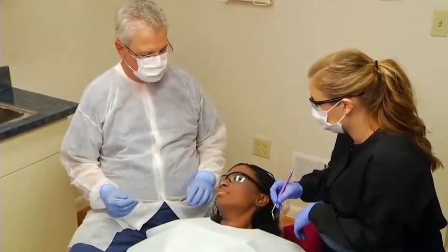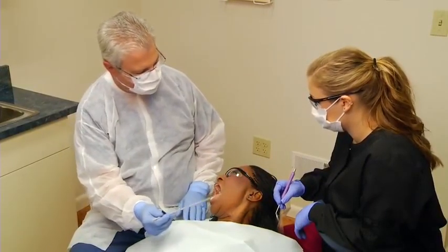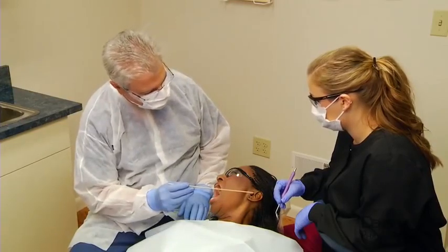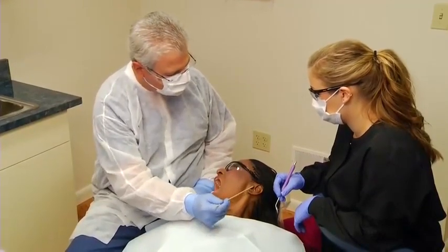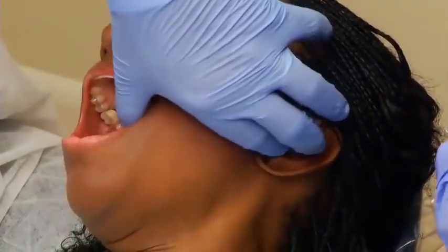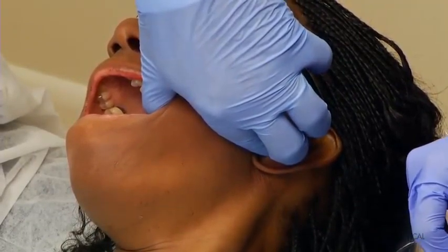The patient is requested to open maximally for this injection. External landmarks, the angles of the mouth, and the inferior border of the tragus are visualized and the plane of insertion identified. The flare of the tragus is also evaluated to determine the angulation of the syringe within the insertion plane. The cheek is then retracted with the left hand. For convenience, the thumb may be placed on the anterior border of the ramus.